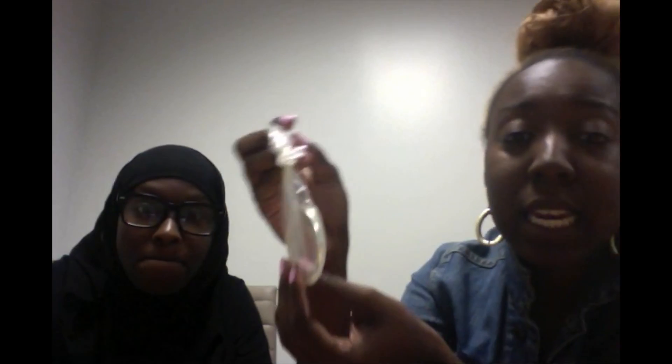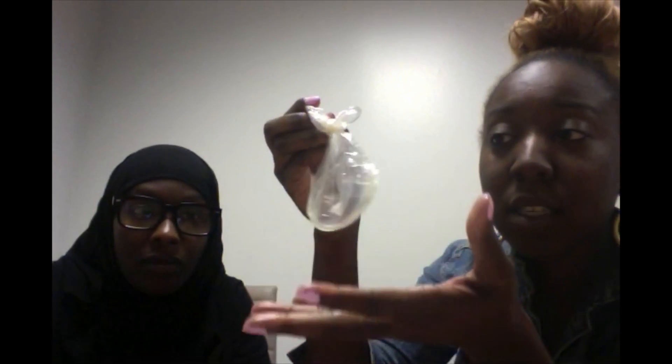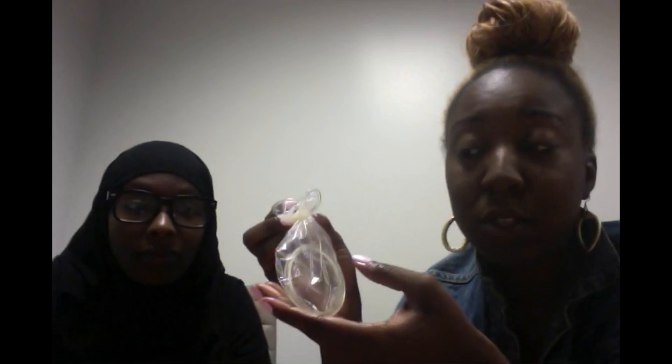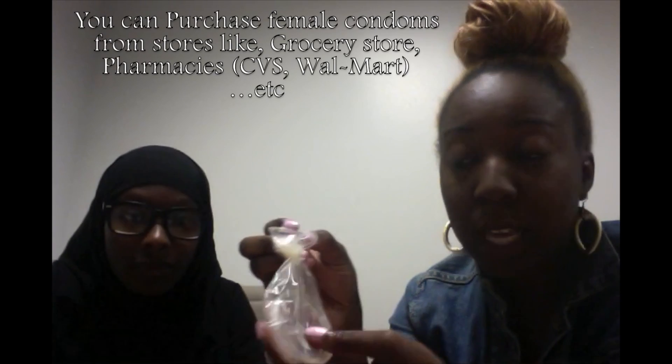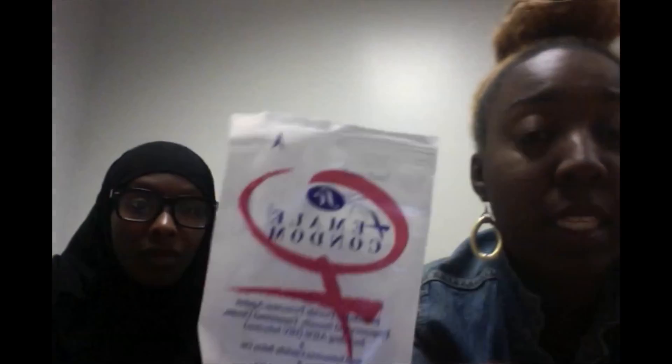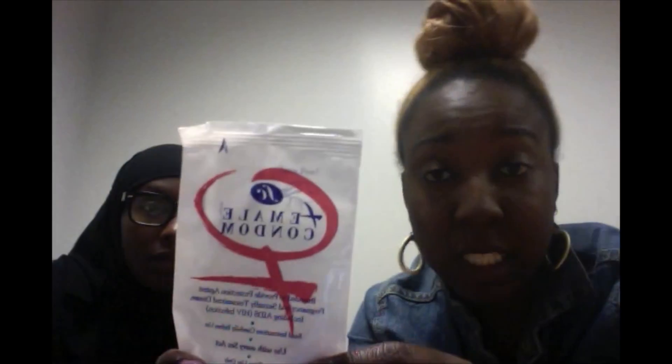Once it's tied in a knot, you're basically just going to wrap it up in some tissue and throw it away in the trash can. That's pretty much how to do a female condom demonstration. Now the places you can pick a female condom up — here's the female condom, and this is how it's going to look if you purchase it.